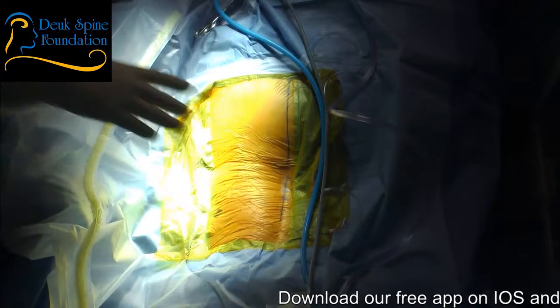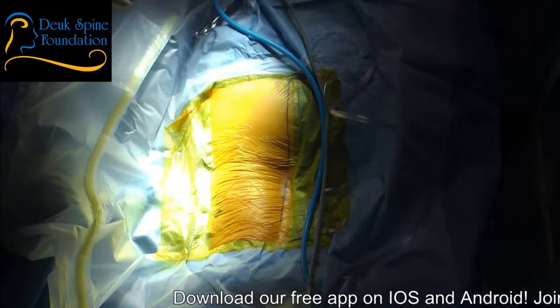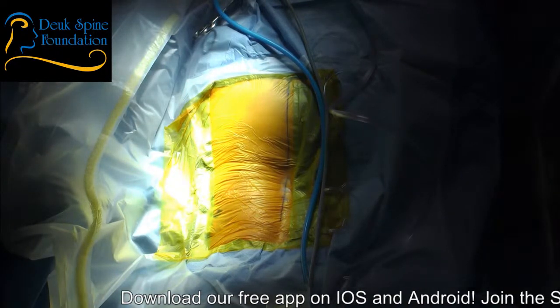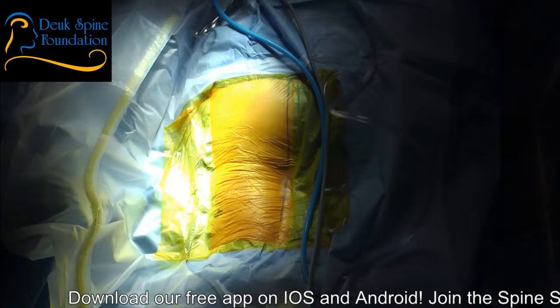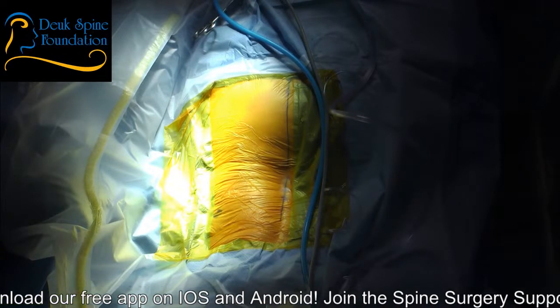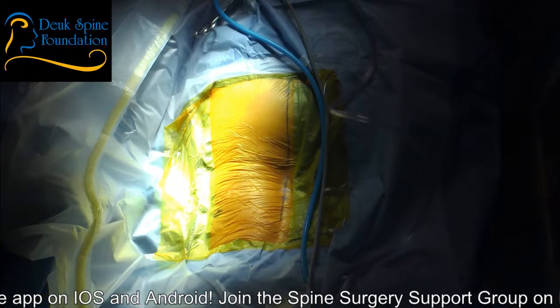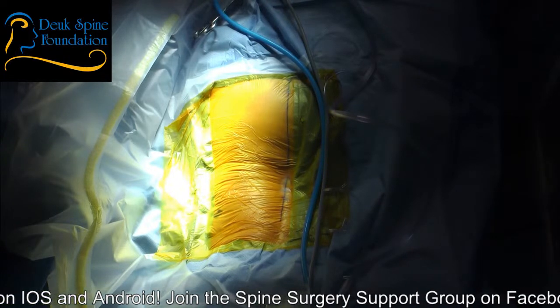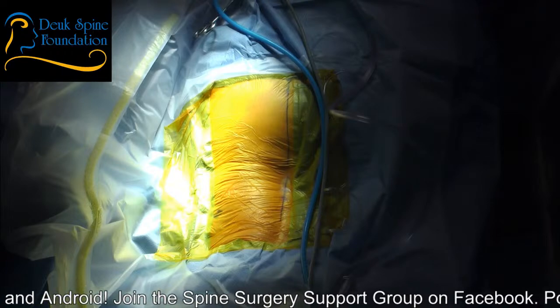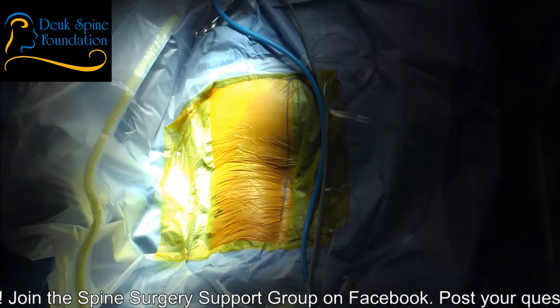As always, our patient is awake when we do lumbar Duke Laser Disc Repair, and Duke Laser Disc Repair is endoscopic spine surgery. We are going to make a tiny little incision in the skin on the side and go in at a 45 degree angle to the spine, going in through a natural hole that is already there called the neuroforamen. I have to say this is going to be one of the tougher ones to do. Without further ado, we will get started.